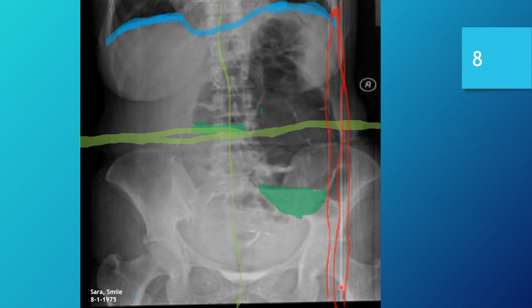Moving on to number 5, reference information. Well, we do know that there is an anatomical marker present on this image, but we're not entirely sure if this is accurate. As I said, this image could be mismarked or it could be presented improperly. And then here we have our partial patient reference information, name and birthday. We still need that medical record number to make it complete.